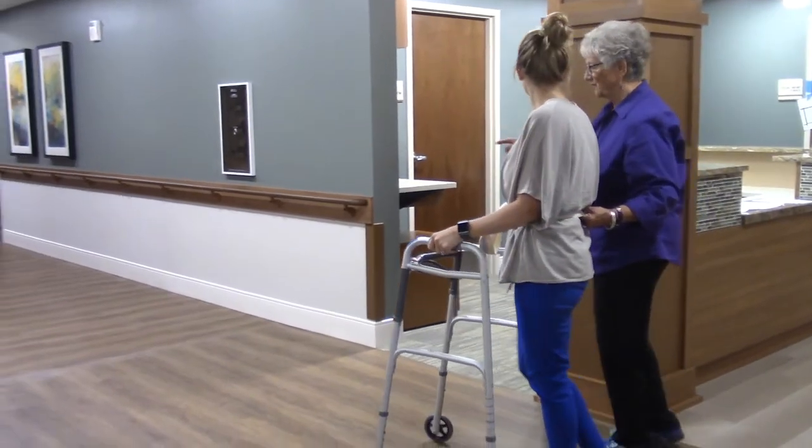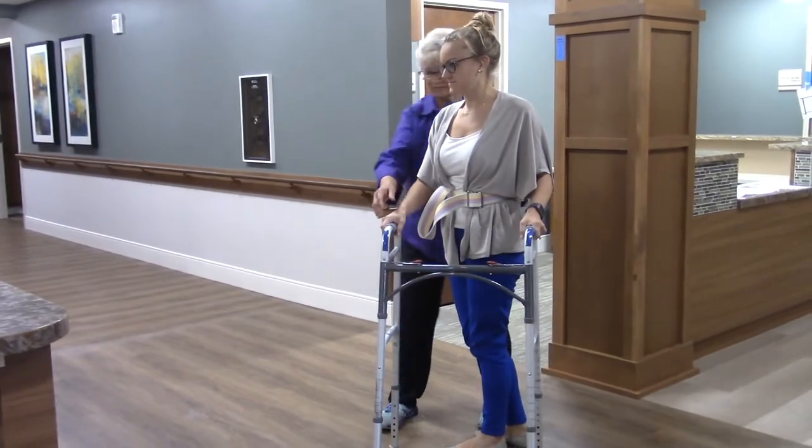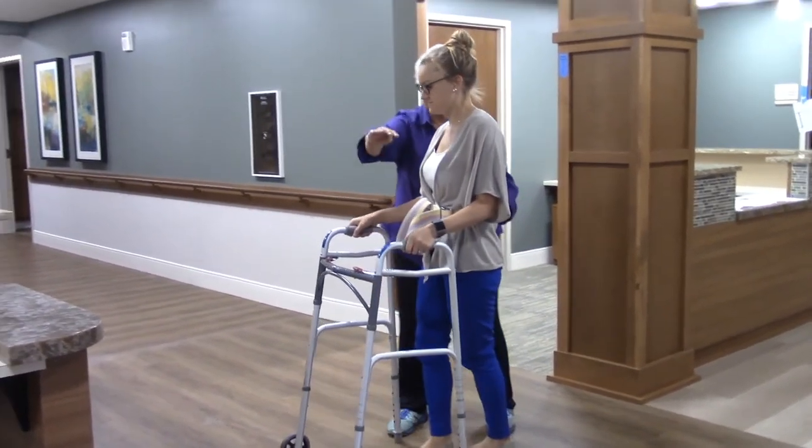Walk beside the person as they use the walker. Avoid sharp turns as you are changing directions. Instead, cue the person to make slow, wide-angle turns.